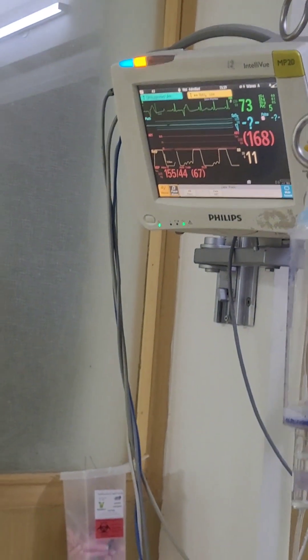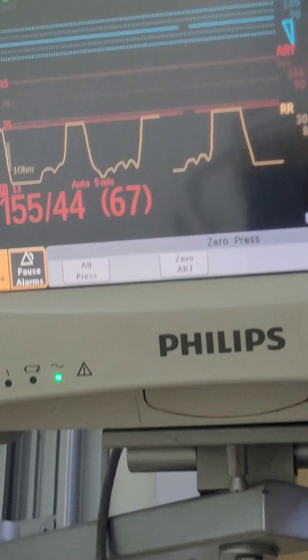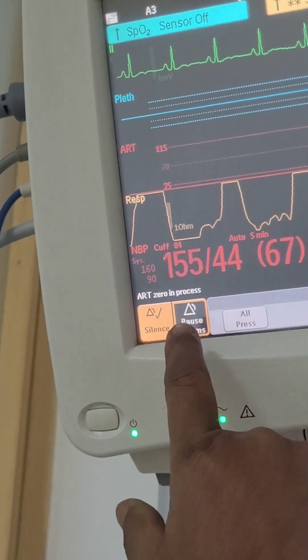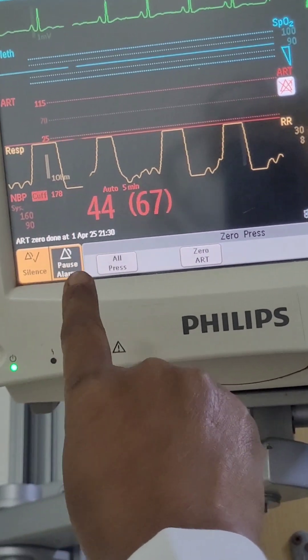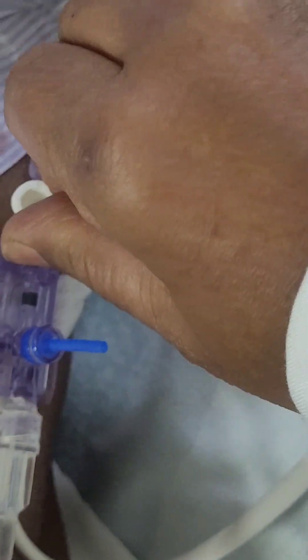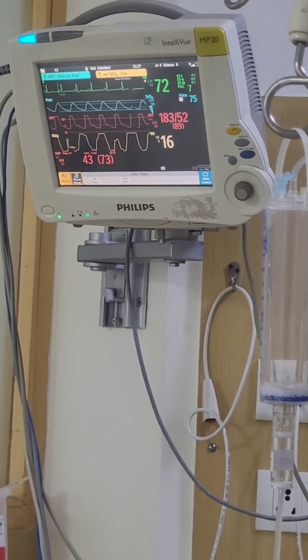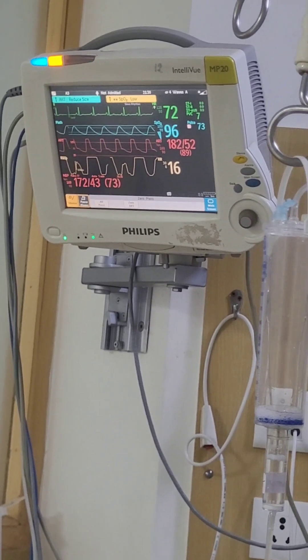As I have opened the atmospheric end, you can see the waveform has gone. Now on the monitor, I have to select zero. I will select it — you can see what it is saying: 'Art zero in progress.' And now: 'Art zero done.' So I close the atmospheric port and open the patient end again. Once I open the patient end, you again get the waveform. The zeroing has been done and you have an optimized arterial line waveform.